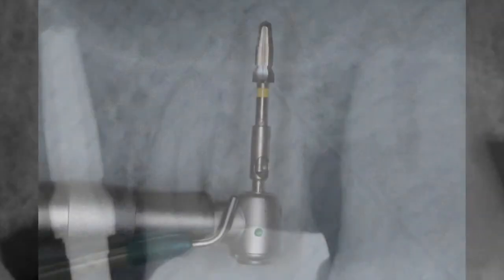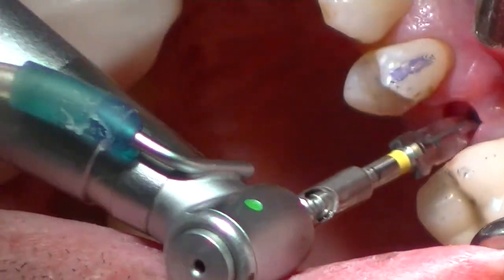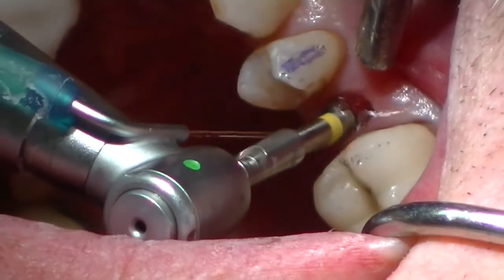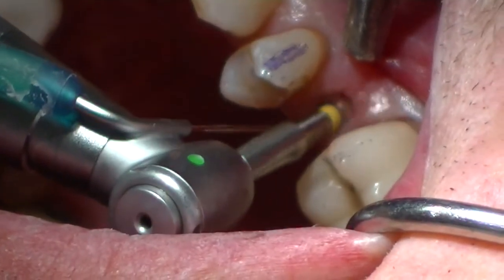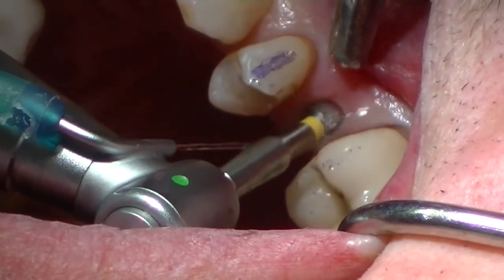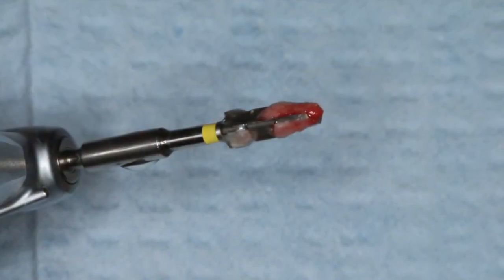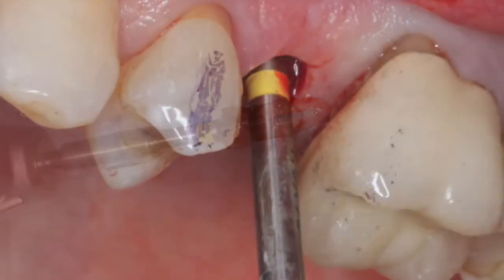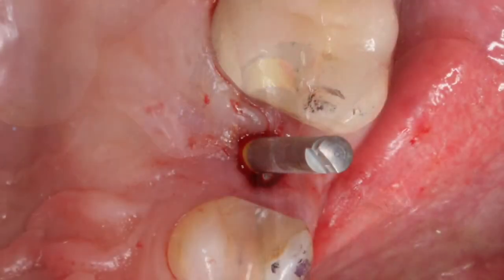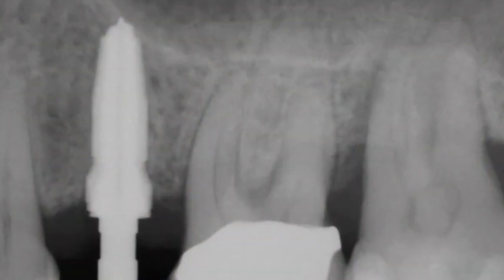Now I'm going to widen to the 4.3 diameter tapered burr. These burrs go very, very quickly — it's really a five-second procedure because all it's doing is widening that bone. We're going to take a stop and take a radiograph to make sure we're in correct position, and look at the bone that's harvested from that site. Looking mesial-distally and buccal-lingually, we're right in the center of the central groove. We have good attached gingiva and we're right at that floor.